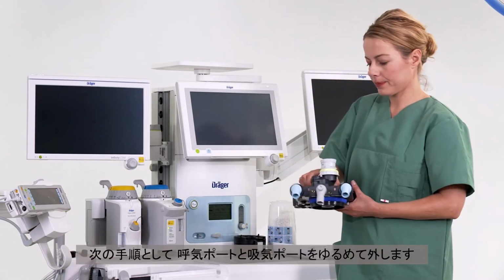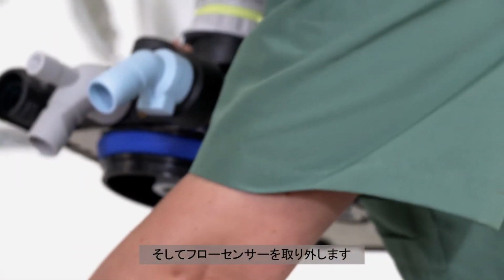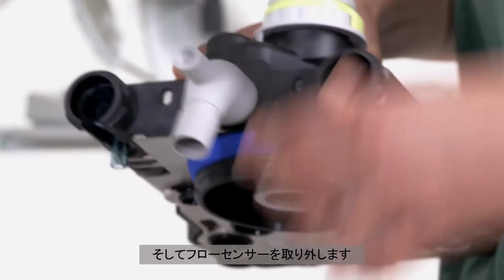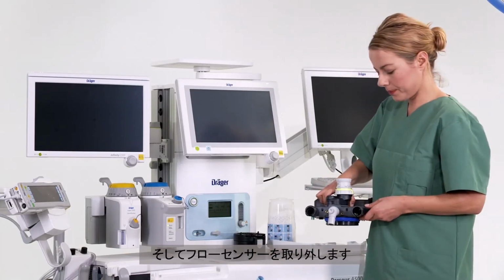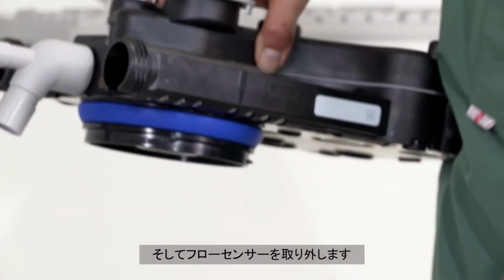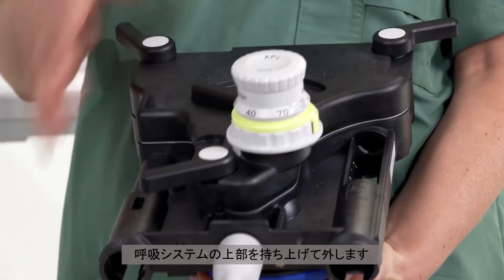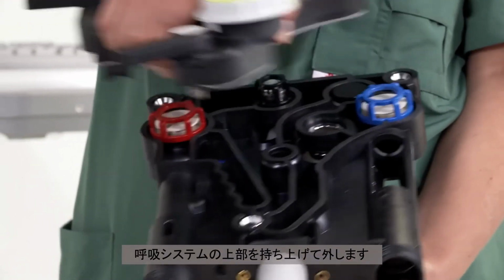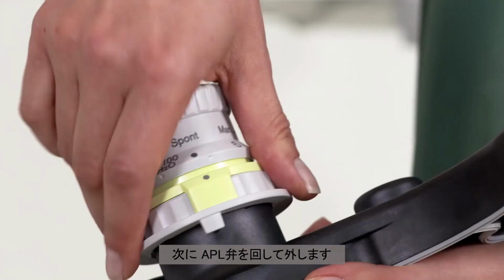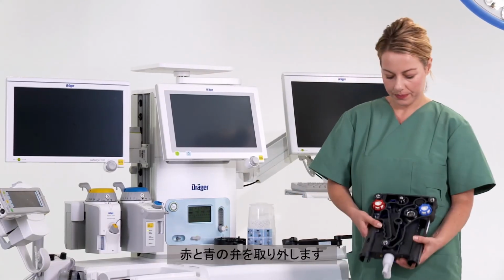As a next step, loosen the inspiratory and expiratory ports and remove the flow sensors. Turn the 3 levers counterclockwise and remove the upper part of the breathing system by lifting it up. Now unscrew the APL valve. Remove the red and blue valve.